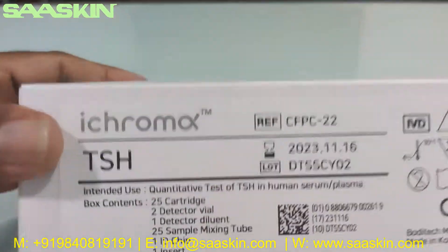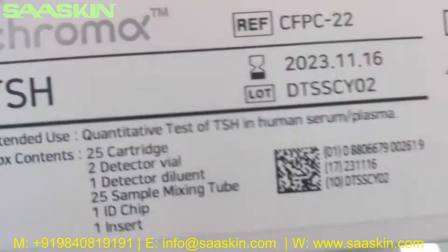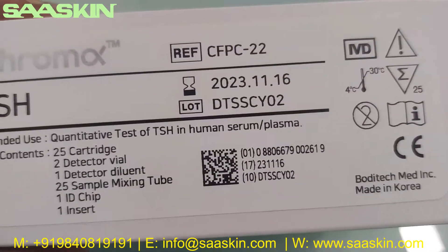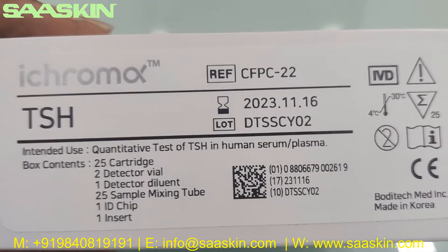Basically, if you look at this, the product is from Korea, from Boditech, and it is a TSH test kit. It is a CE-IVD certified product, as you can see here. It is intended for use as a quantitative test of TSH in human serum and plasma.